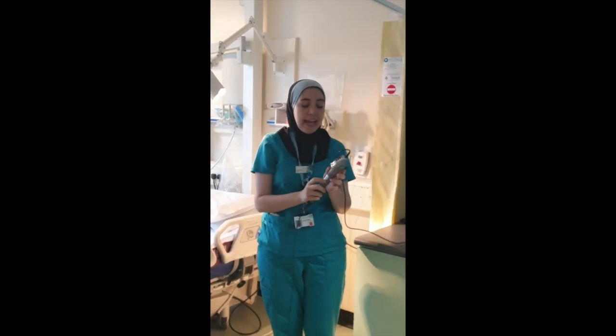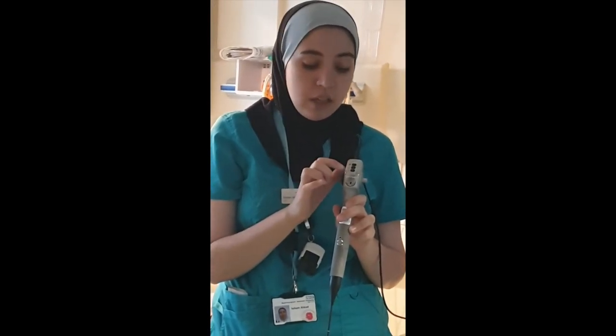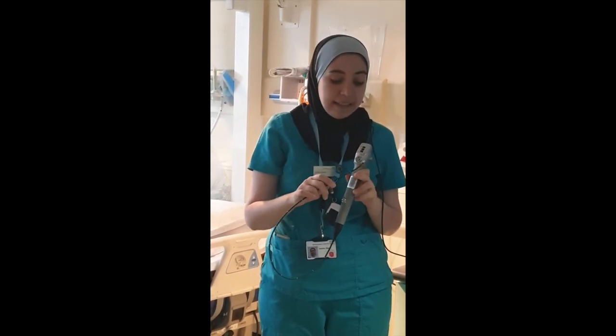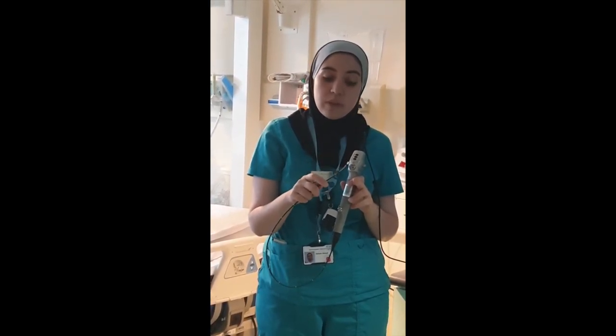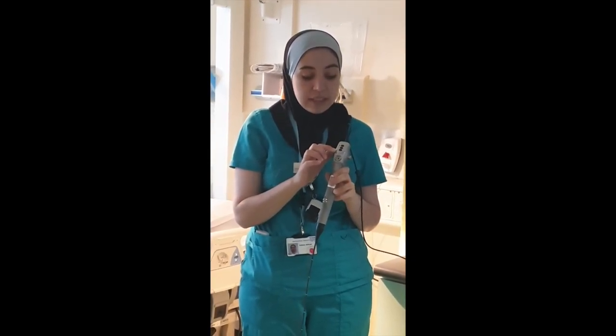Moving on to the top of the handle, you can see that there's a few buttons here. And these buttons are important for when you are actually operating the bronchoscope. So at the top here, you have a button which is used to start and stop recording videos. And in the middle, you've got a button for the white balance. Before you start using the bronchoscope, it's very important that you take a piece of gauze to the distal tip of the bronchoscope and that you press this button to ensure that the camera gives you true white colours. Lastly, as you can see here, there's a button which is used for taking still images as well.